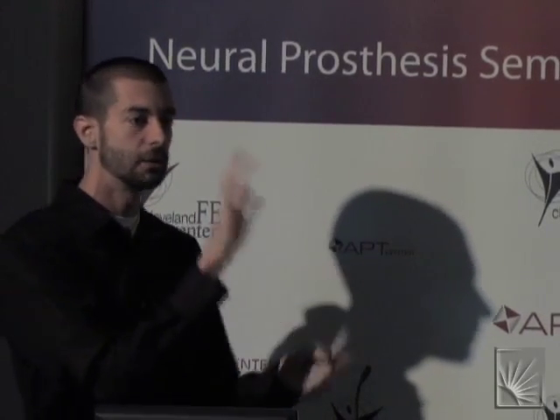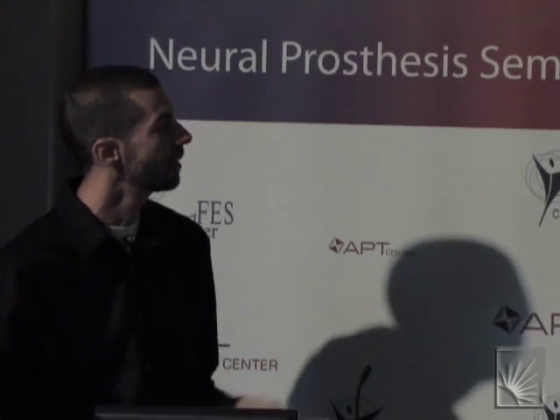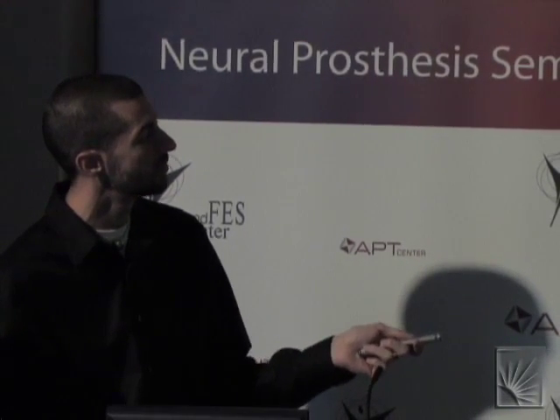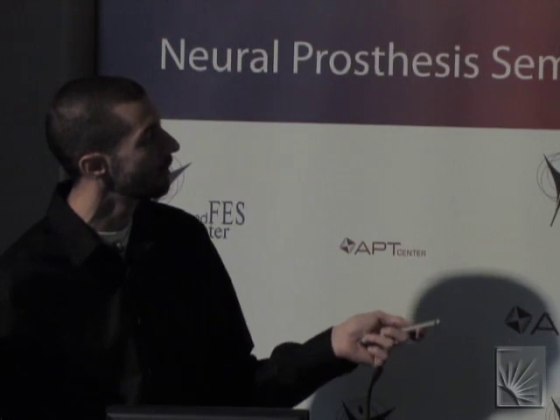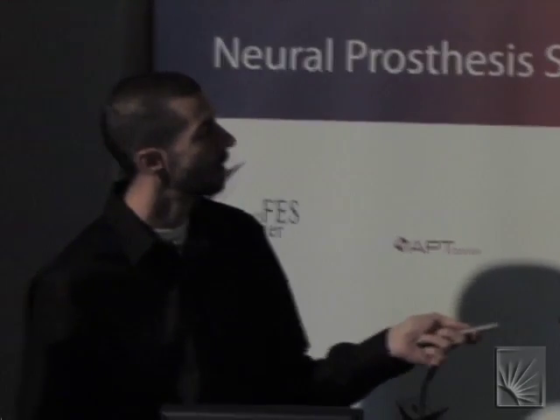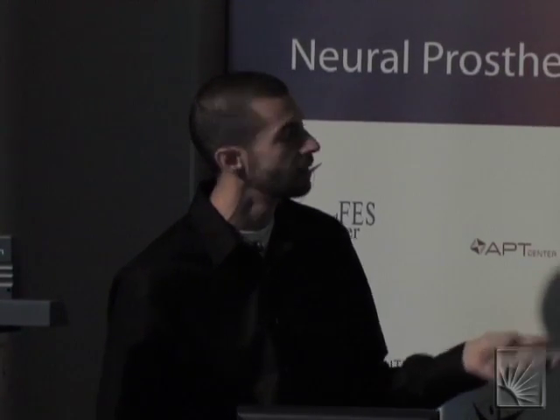And if you do that and you lay these things onto each other, if we did this in this particular patient, the brain atlas would suggest the subthalamic nucleus is right here, but the microelectrode recording would say that the subthalamic nucleus is right here. I mean, these are pretty big differences. This is about a 10 millimeter span from probably this point to this point. So that's way off, right?